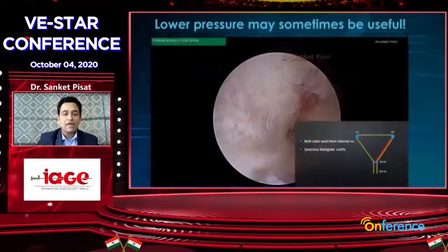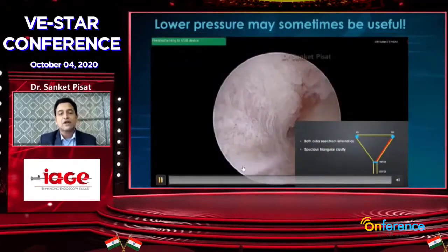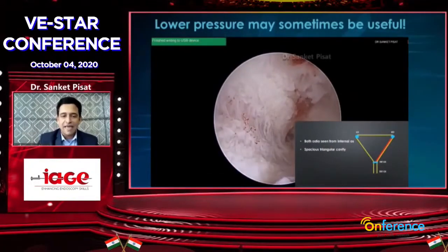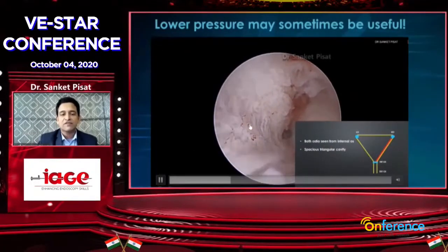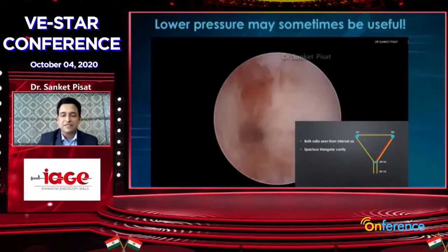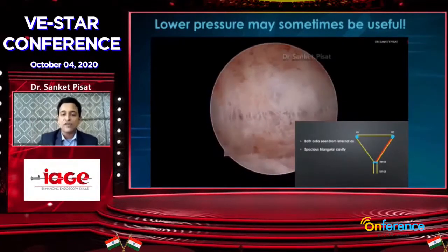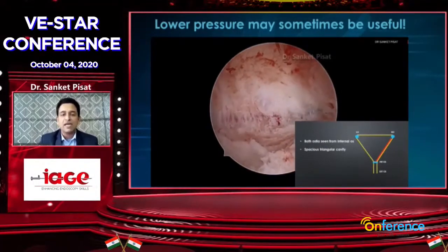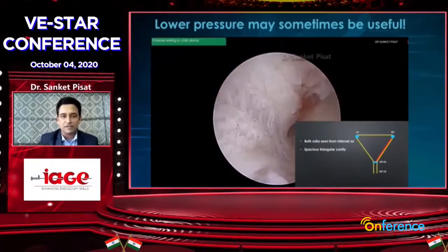It also helps when you are doing synechiolysis or lateral metroplasty. At the end point of surgery, as Rohan showed, just narrow down the pressure a little bit and you will see fine blood vessels coming up, which shows you that this is the end point of the surgery and that this is enough. This is time to stop the surgery, as you've reached a good vascular plane. So in case you are giving too much intrauterine pressure, you can never make out these soft markers.